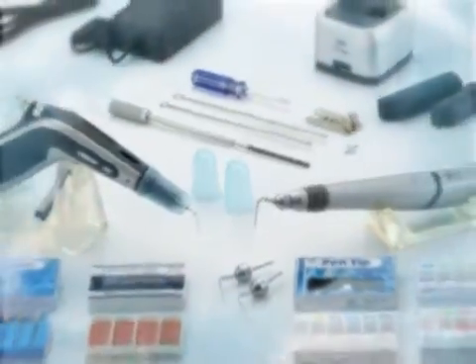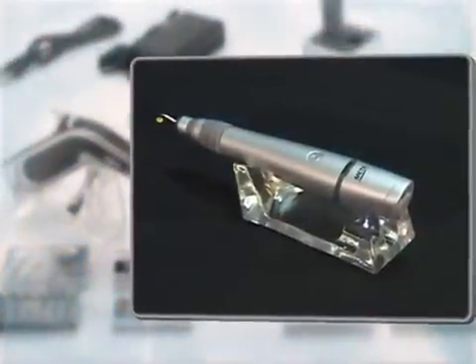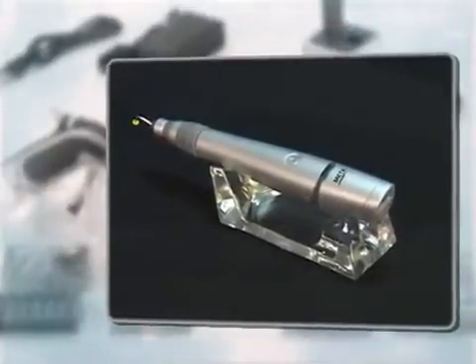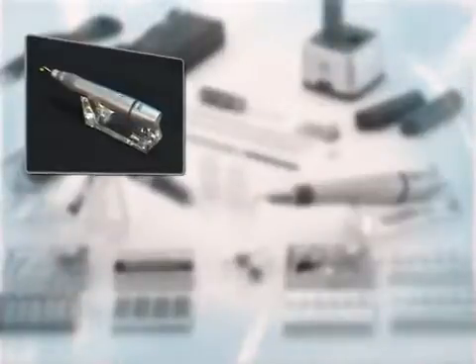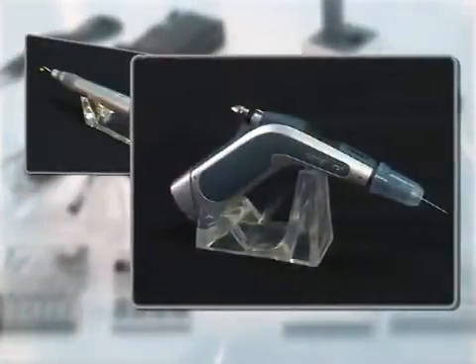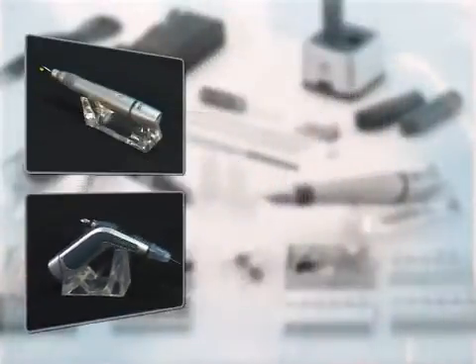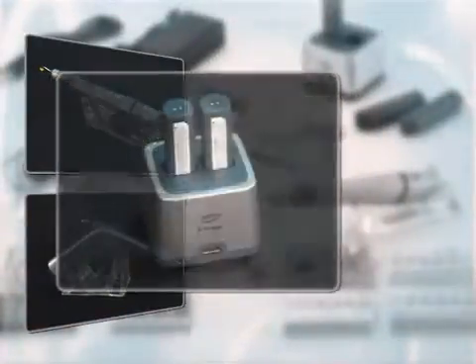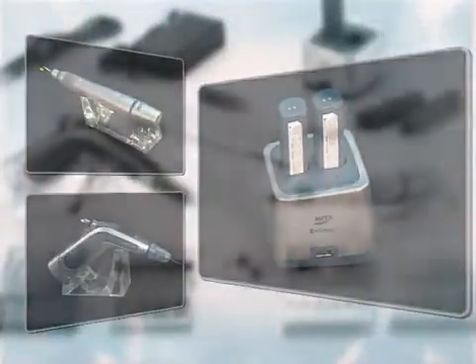These are the components of E&Q Master: the cordless pen, which features taper matching with Gutta-Percha cone plus quick heating and cooling; the clicker-type cordless gun, which allows you to insert softened Gutta-Percha into the root canal; the charger, which can charge two batteries at the same time; and other accessory tools.